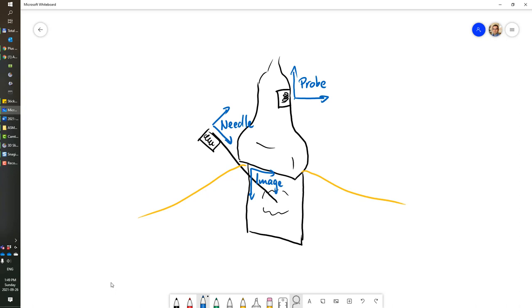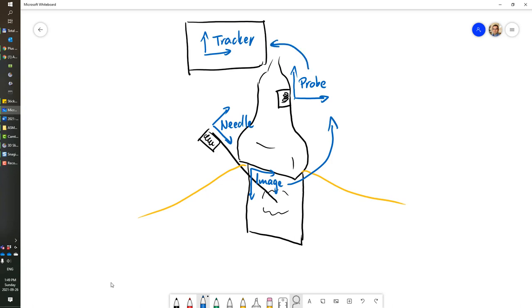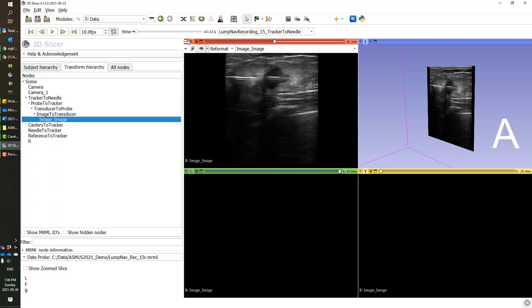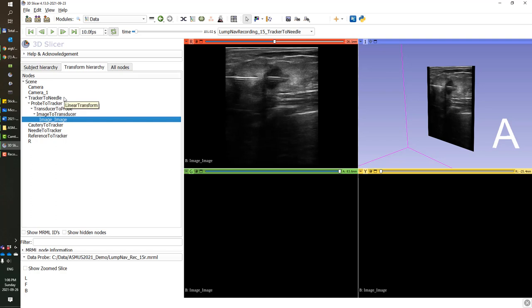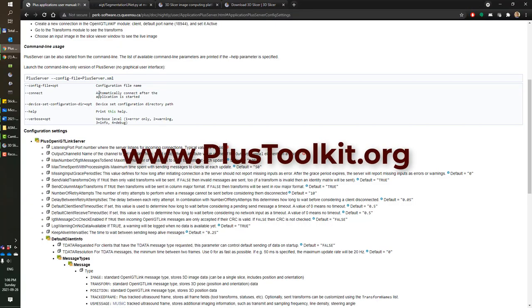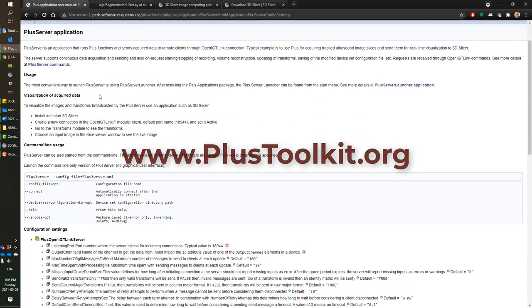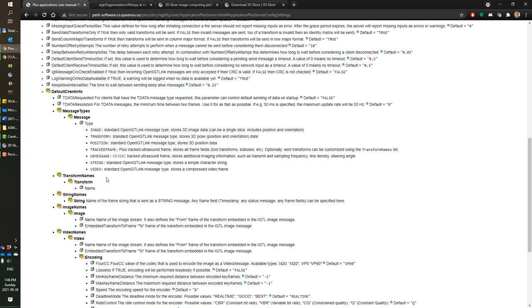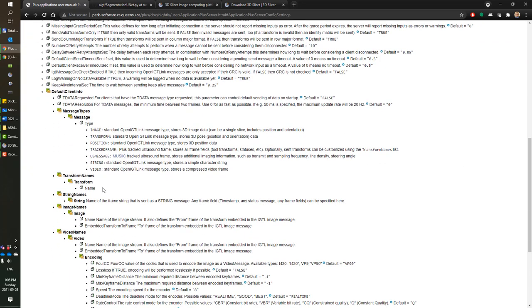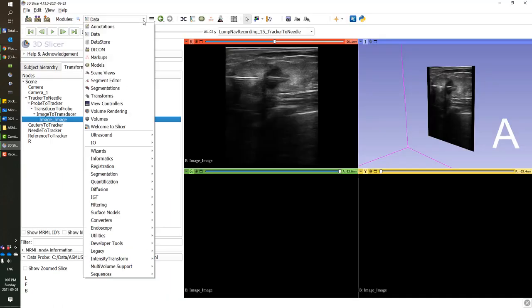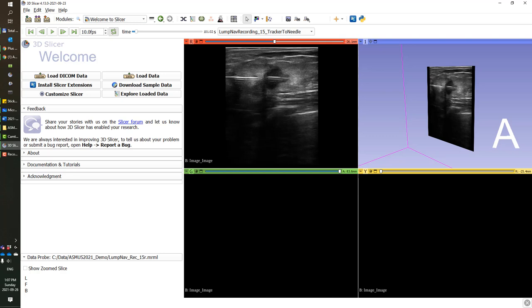The image is fixed relative to the probe, and we have a tracker that is usually the EM field generator, which transforms everything to the needle coordinate system in our configuration. You can see this reflected in the transform hierarchy in Slicer. The image goes through a series of transforms that end in the coordinate system called needle. To have these transforms in Slicer, you will need to configure your PLUS and get all these transforms. Just check the PLUS application user manual. You will need to go to the PLUS server section and list all these transform names to have these sent to Slicer.